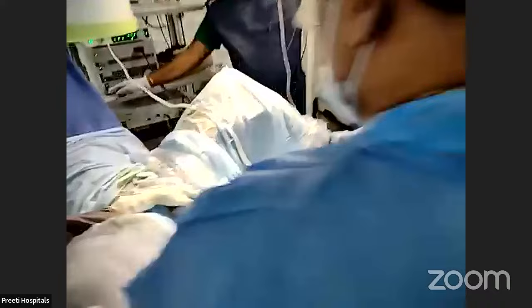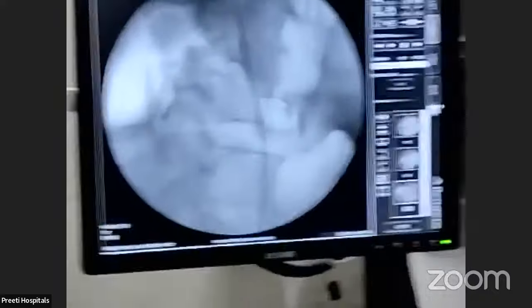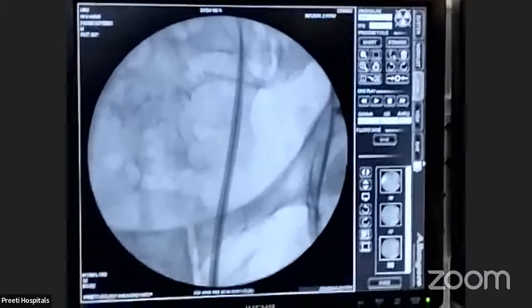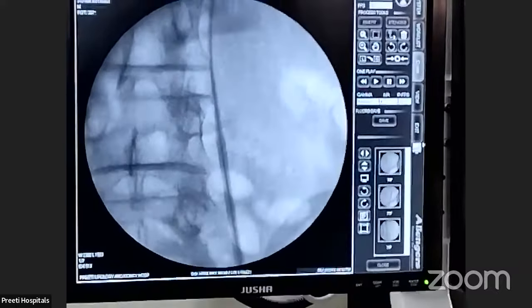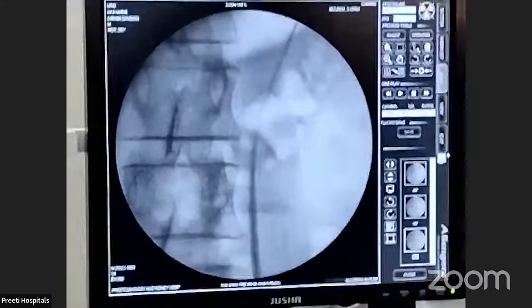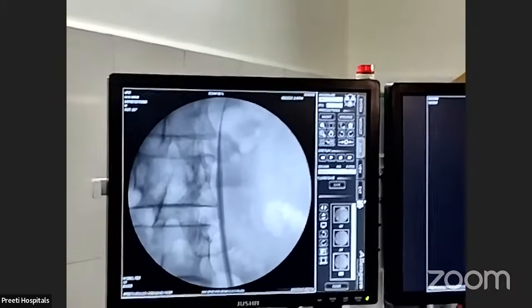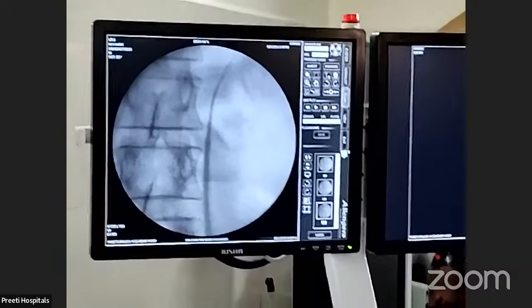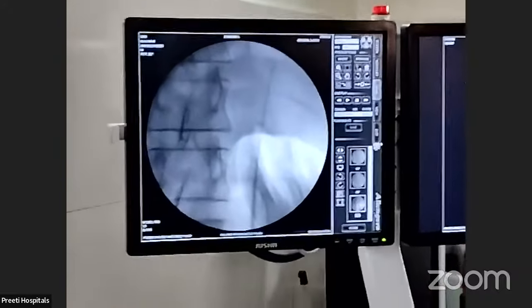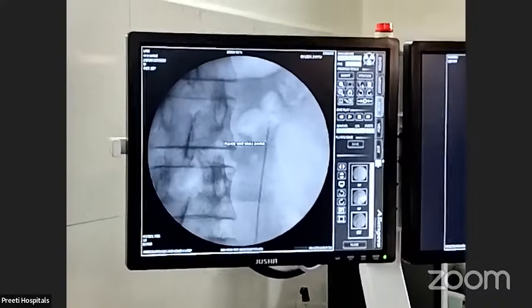So, I am trying one more time. If that doesn't go, CM below. CM below, water you have to put continuously. It is not going. Merge, it is not related to merge. It is gripping at the lower ureter. Don't remove the guide wire, push the guide wire, see that.